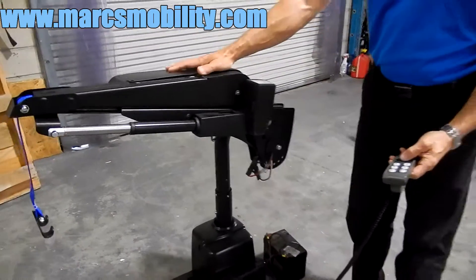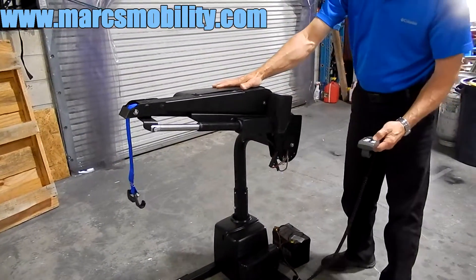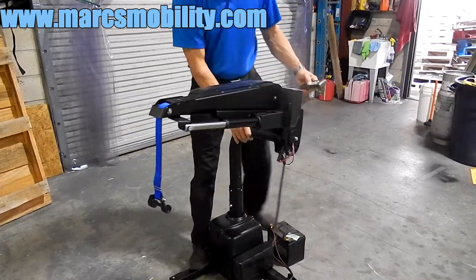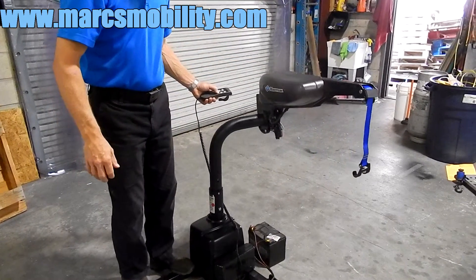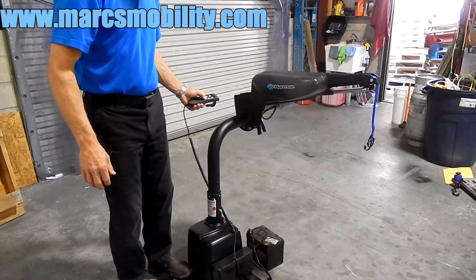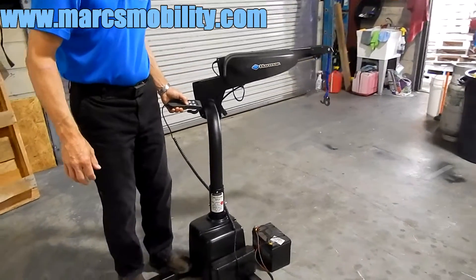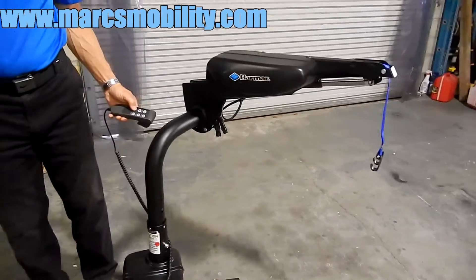And then to bring it back into the vehicle, or to go out of the vehicle, you would rotate out. I'm going to step in on the lift here so the lift doesn't swing out, but you can swing all the way out with your lift and pick up your power chair or your scooter outside the vehicle and bring it back in.